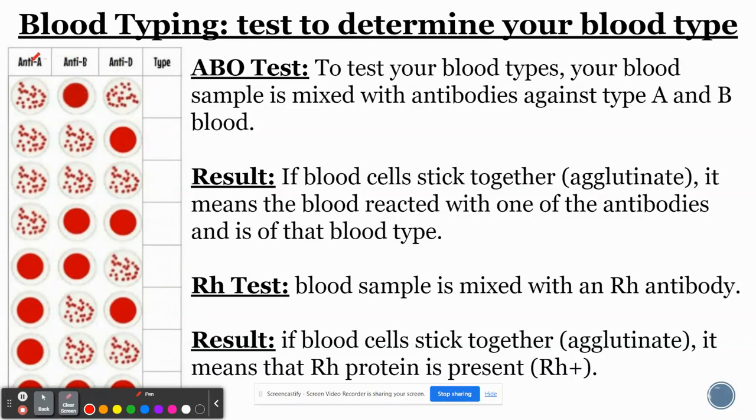So blood typing, basically the way it works is we take a sample of your blood, and we test it with different antibodies. So for example, I'll test it with anti-A, antibody A, antibody B, and also antibody D. So the ABs in it basically tests to see what carbohydrates are present on your blood cells. So you'll see when I put antibody A, there's clumping that happens. This represents clumping, this picture. So that means that I probably have some A on there.